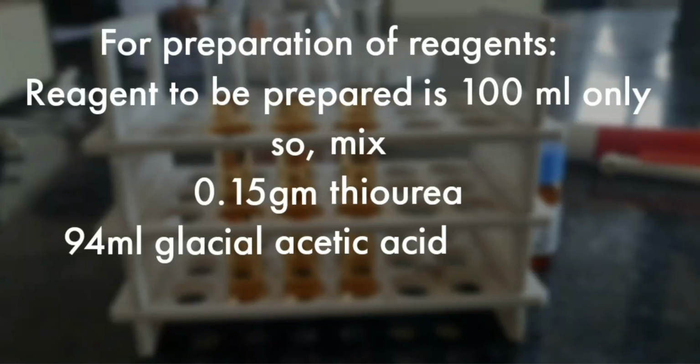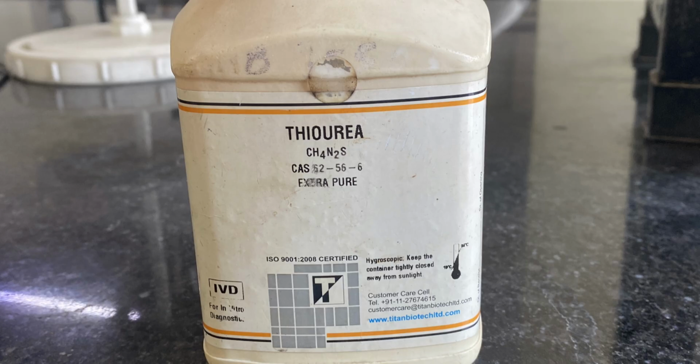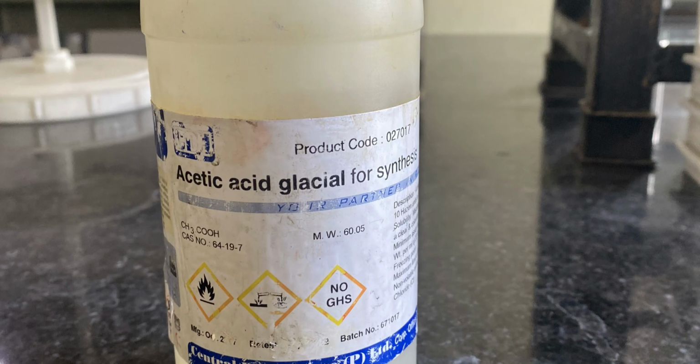For preparation of reagent, only 100 ml is needed, so we will be mixing 0.15 grams of thiourea, 6 ml of O-toluidine and 94 ml of glacial acetic acid.